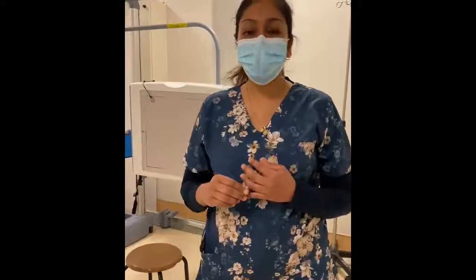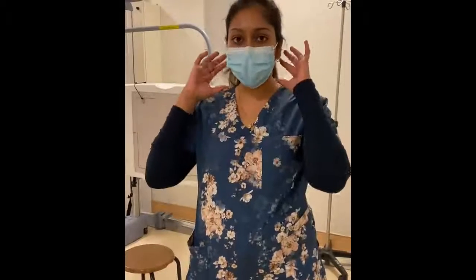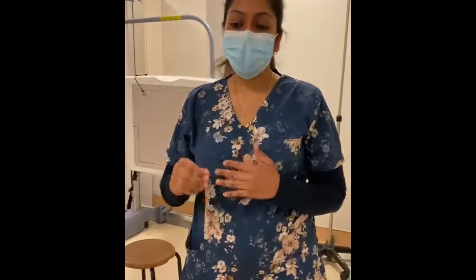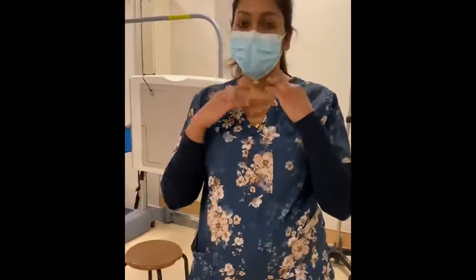Remember to use radiation protection as well as to remove all artifacts from your patient's area of interest, which is your earrings and everything from the facial area. In terms of your clinical indications for facial bones, basically you are checking for fractures, neoplasms, or inflammatory processes of the facial bones, the orbit, as well as your mandible area.